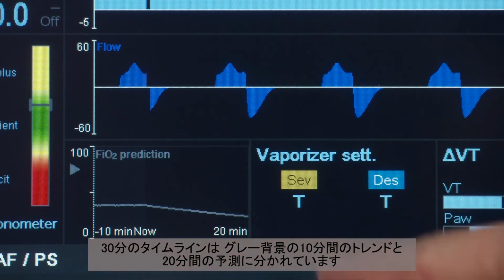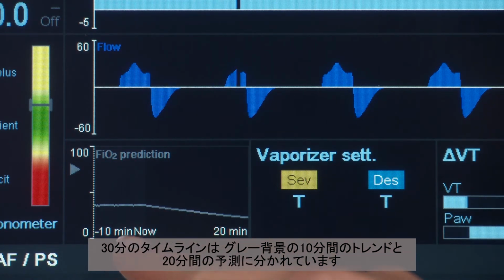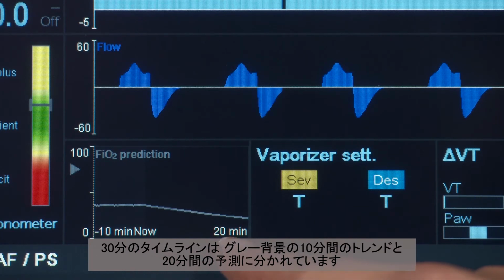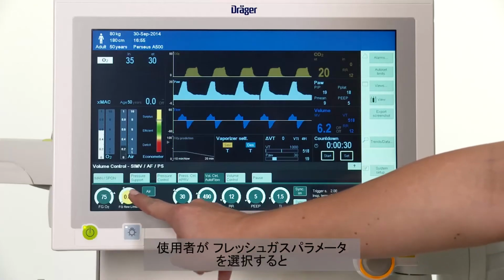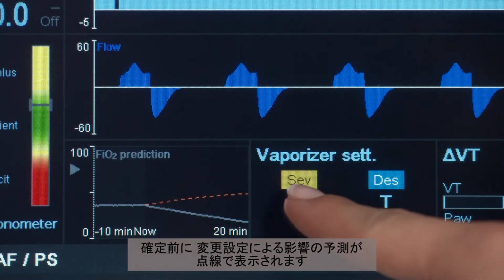The 30-minute timeline is divided into a 10-minute trend with a grey background and a 20-minute forecast. If the operator selects fresh gas parameters, a dotted line will show the predicted impact of changed settings before they're confirmed.